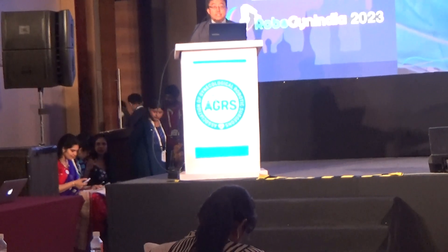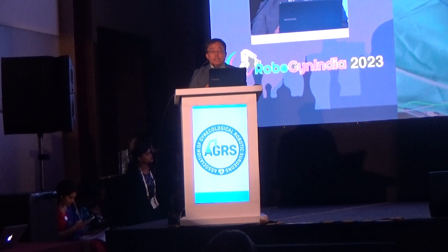For the omentectomy and the para-aortic lymph node dissection, I turn the robotic dock 180 degrees. At this time, the target point is the upper para-aortic area.